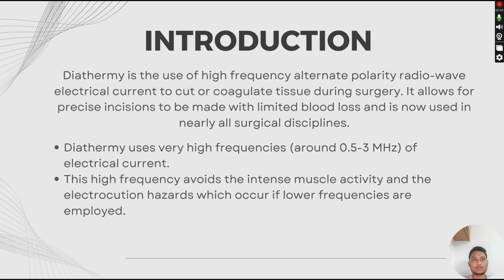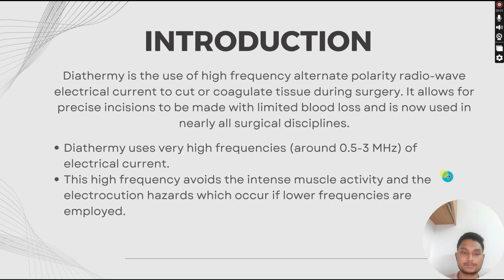Now let's get into the principle. It is actually very straightforward. When high frequency electric current energy passes through body tissue, it is converted into heat, and the heat, controlled carefully, is what surgeons use to cut or coagulate tissue effectively. Let's move to the next slide.